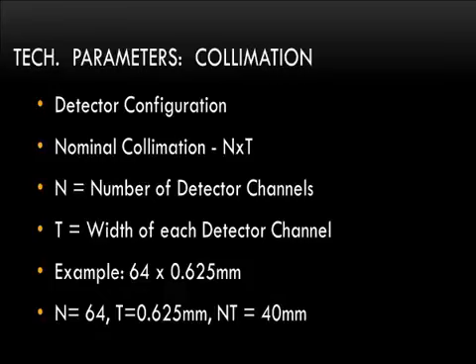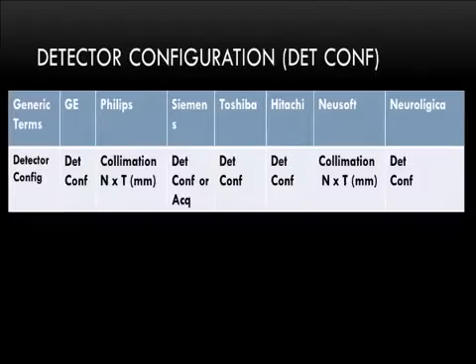Okay? But we usually don't have that information on the user interface, so we're going to refer to it as the nominal collimation. All right, what effect does that have? Sorry, we'll get back to the effects in a second.